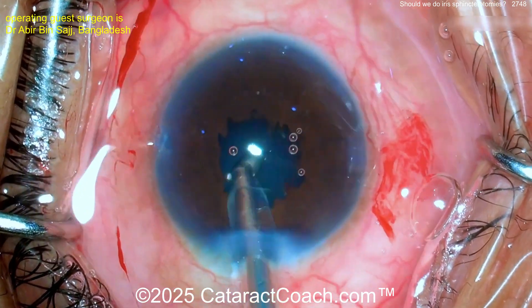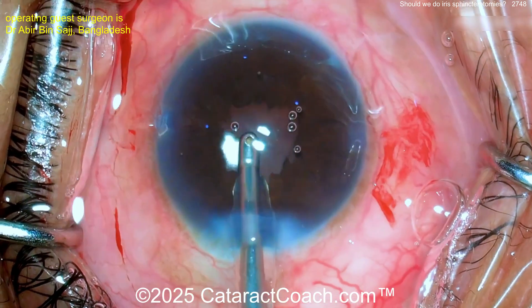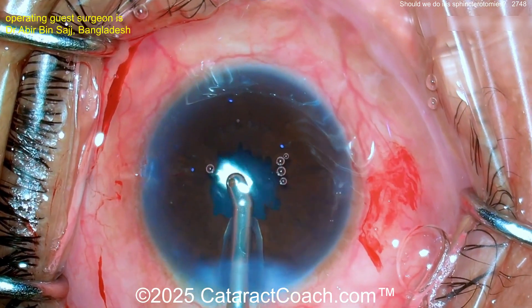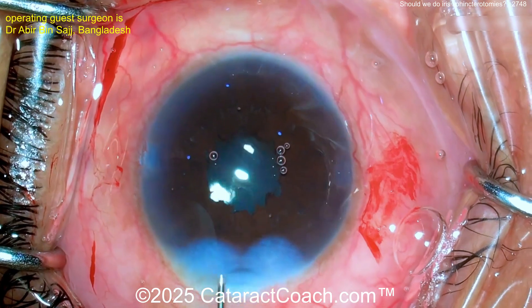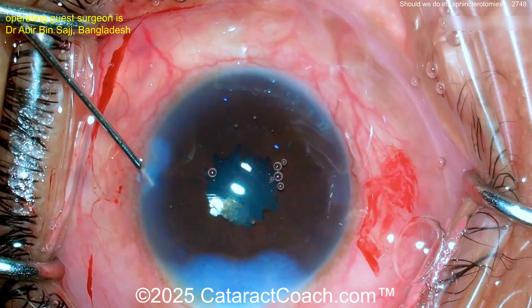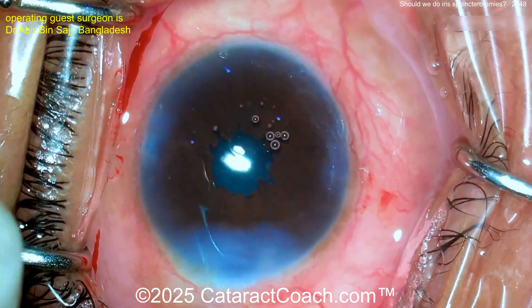In a case like this I'd also put some intracameral preservative-free triamcinolone inside the eye, because all that iris manipulation can cause more inflammation in the post-op period. To prevent too much inflammatory response, a little intracameral preservative-free triamcinolone — maybe 0.5 mg or 1 mg — would be fantastic. Nice case overall.